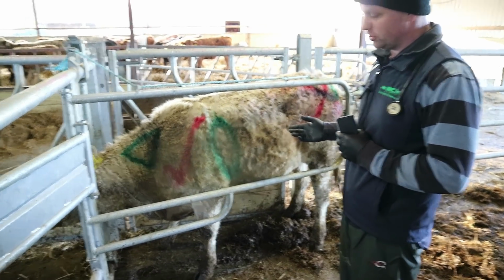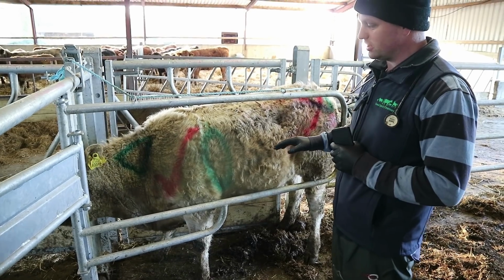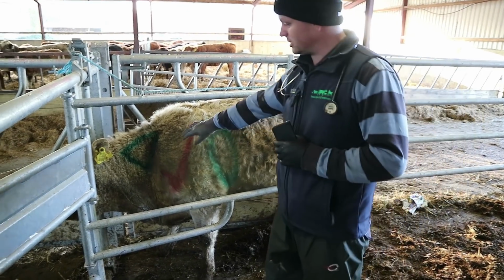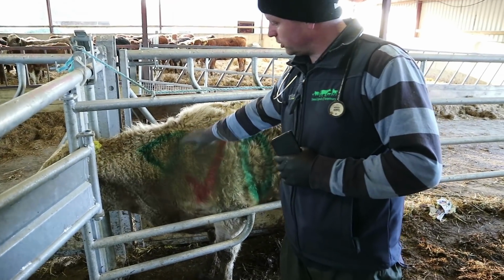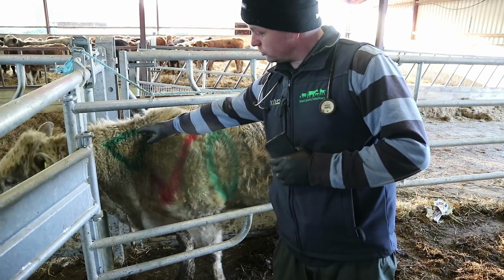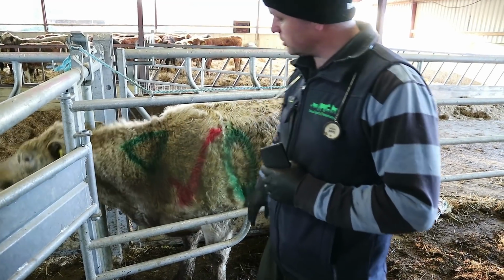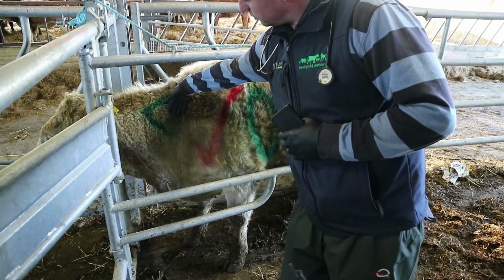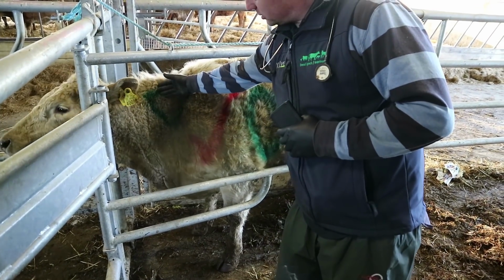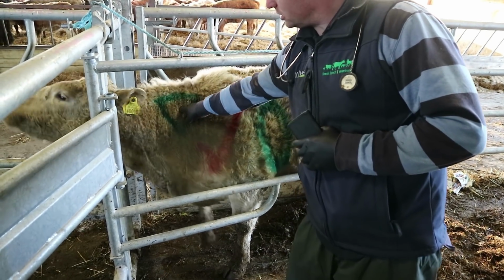If we're giving an intramuscular injection, we're always going to give that in the neck of the animal. So we're going to look at this area marked with a green triangle in the front of this heifer. Okay, so we're going to go with a line down the front of the shoulder, along the top, just underneath the top of the neck, and a triangle joining the two ends of those lines. So we're largely speaking talking about 4 inches forward from the shoulder, which is roughly my hand, and 4 inches down from the top, which again is my hand's width, and we're going to inject straight in here into the muscle.